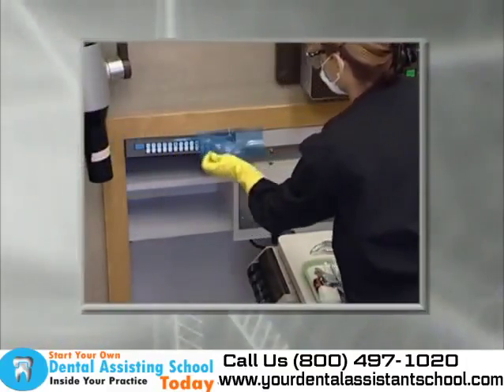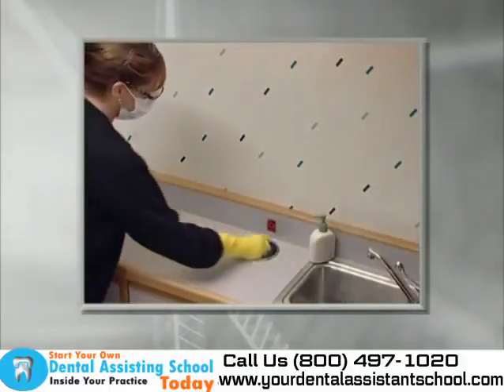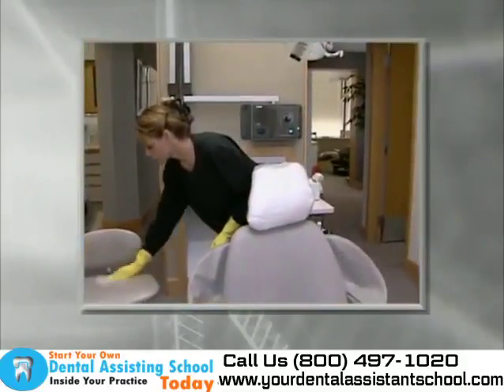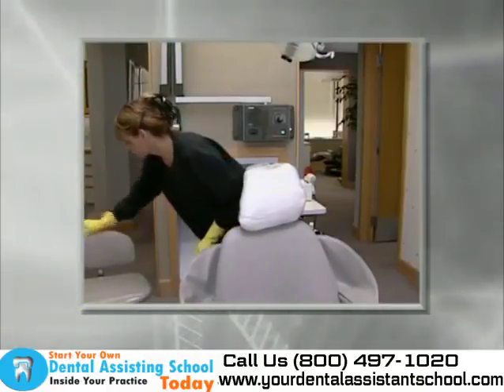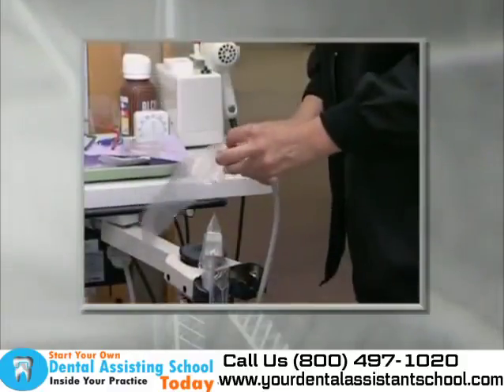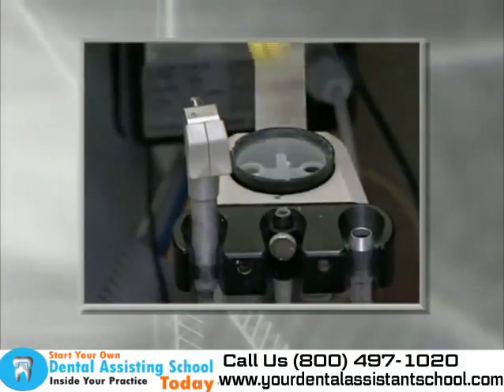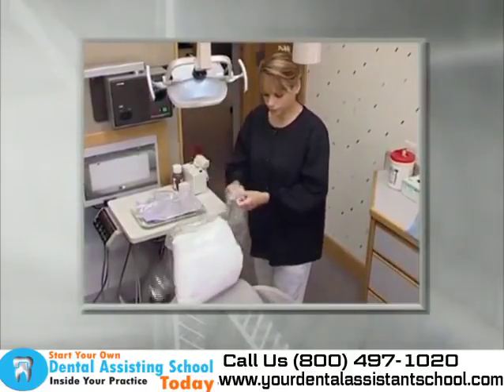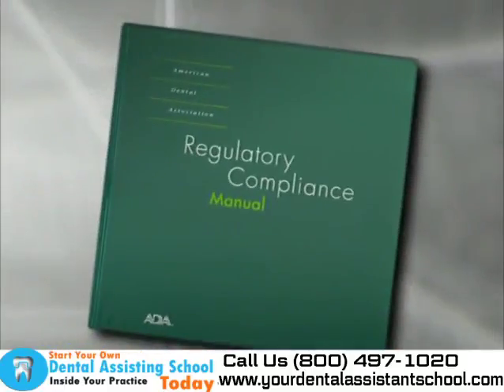After a patient has been treated, the plastic barriers are removed and put into a leak-proof container for disposal according to national and/or state or local regulations. Areas of the treatment room with the potential for contamination should be disinfected before the next patient is treated. After the treatment room has been disinfected, new plastic barriers are put into place for the next patient. A schedule for cleaning dental unit water lines should be established. For additional information on infection control and proper sterilization and disinfection methods, OSHA guidelines should be referenced.